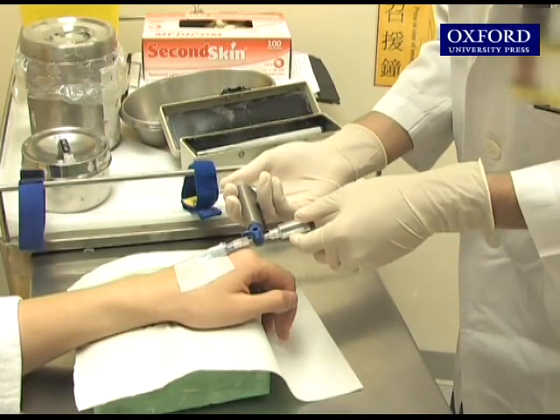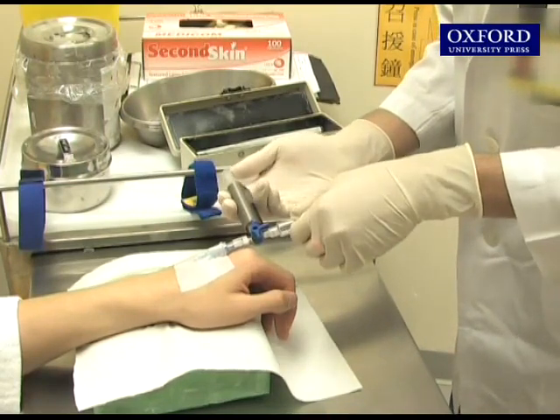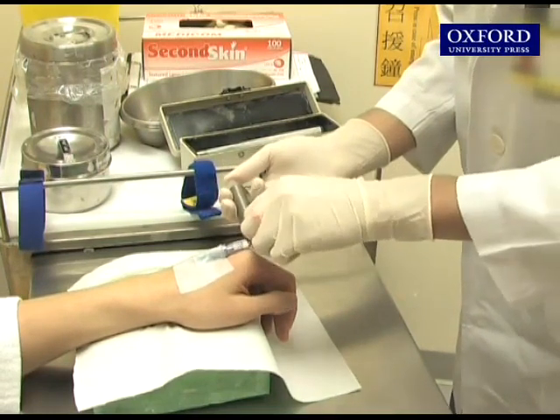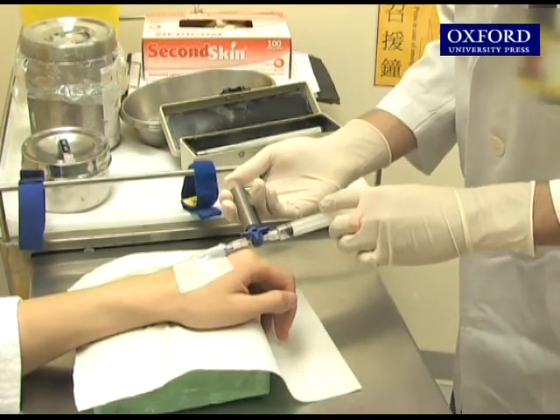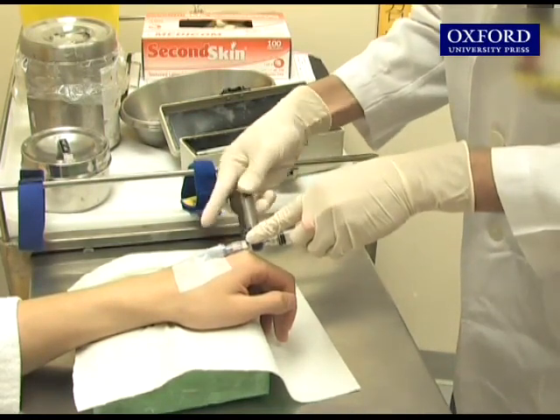After the radioisotope tracer is injected into the patient's body, the patient has to wait for the tracer to accumulate in the target organ. The waiting time varies from 20 minutes to an hour depending on the target organ.